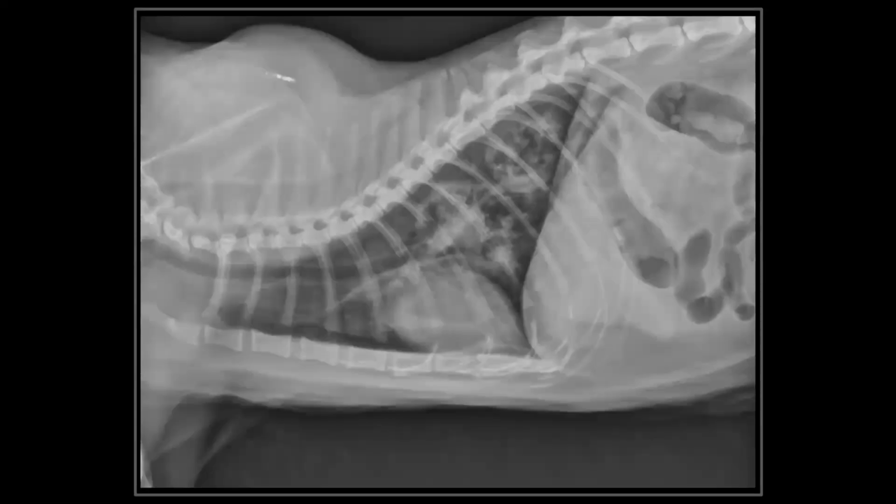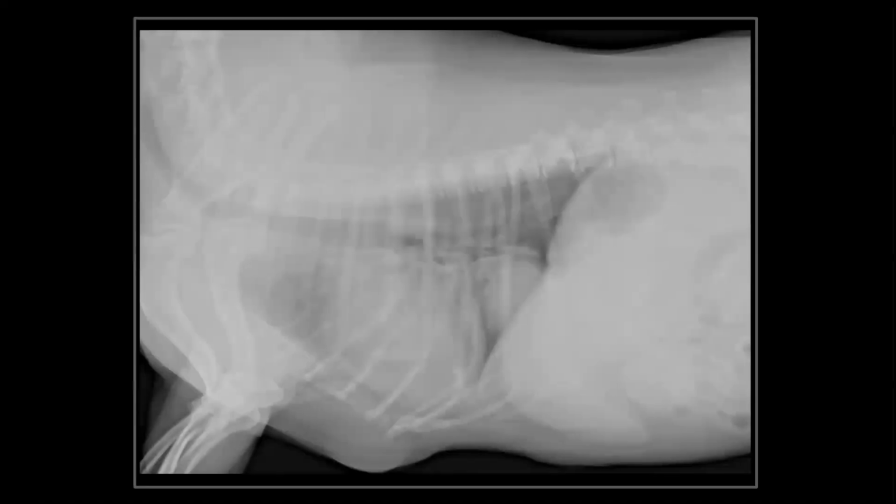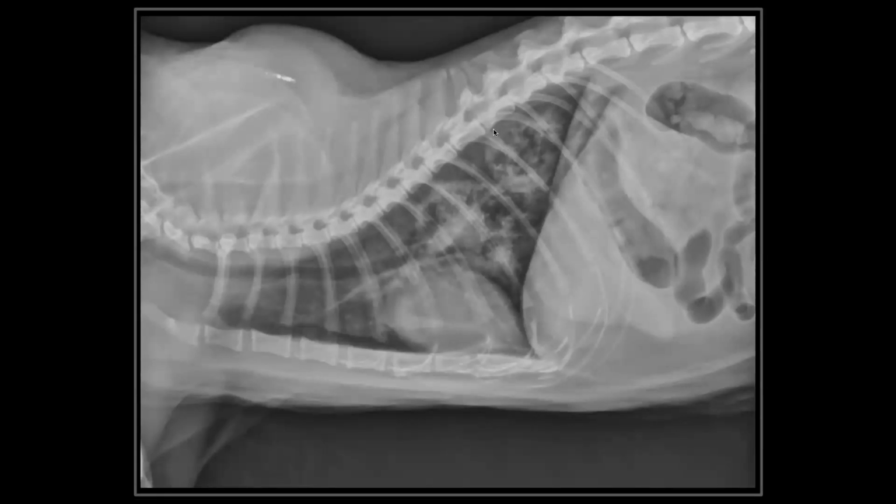Here's another example of pulmonary masses. What we have are several distinct masses in this patient. These masses are well encapsulated, but they also appear to be cavitated, and that actually can occur. It's interesting that either these masses penetrated through the lung tissue and resulted in air in the thorax, or the patient had a transthoracic aspiration to do cytology on the lung tissue, and there was a creation of a little bit of a pneumothorax in this patient.